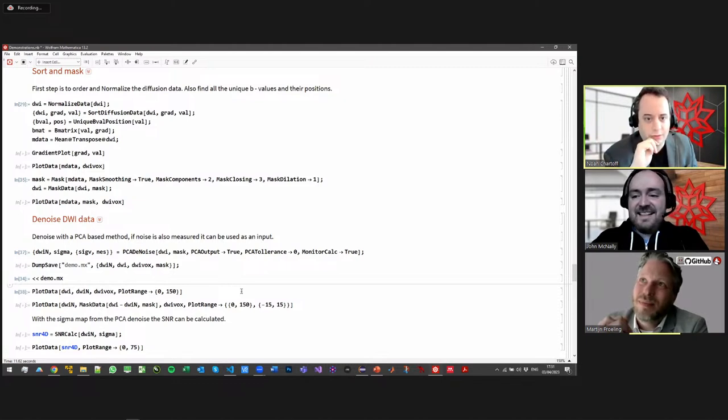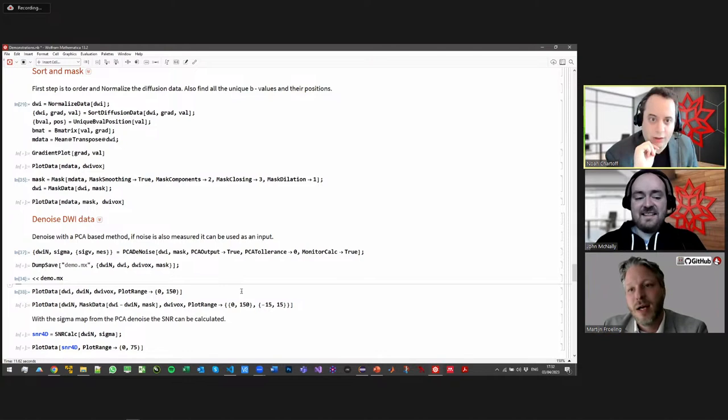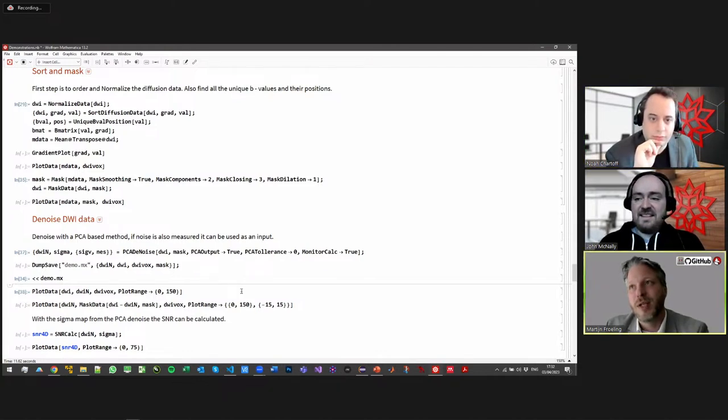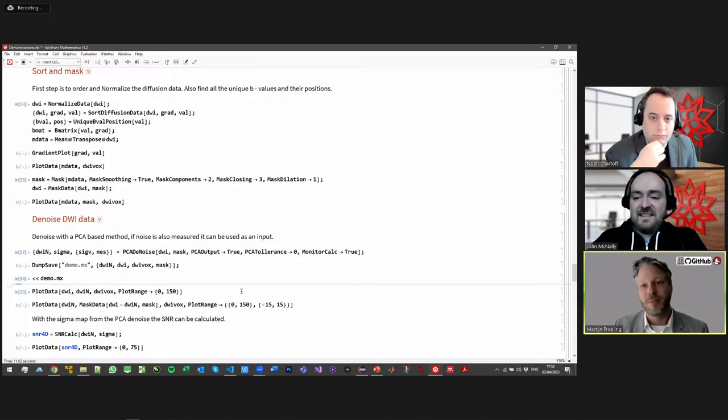Well, you can represent any vector in a basis space. It's the same as dimensional reduction. You try to project your data space onto a lower dimensional representation of that. So you have the typical eigensystem decomposition, where you have eigenvalues, eigenvectors, the principal component, independent components, all different ways of splitting the signal into its basis vectors and the weights of these vectors. And then you can say, well, these are the main components that build the signal, and the other ones are so low in amplitude that I can remove them, and then we make the signal from that.